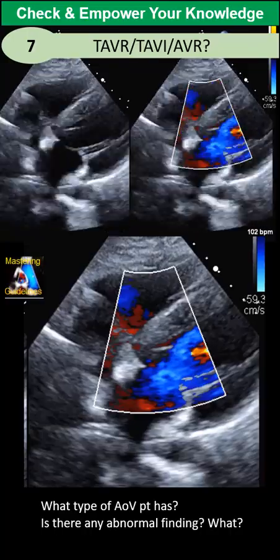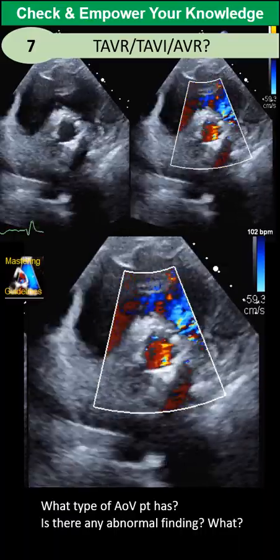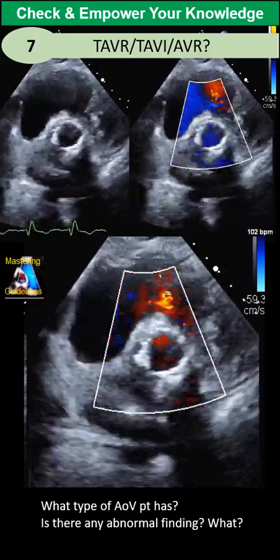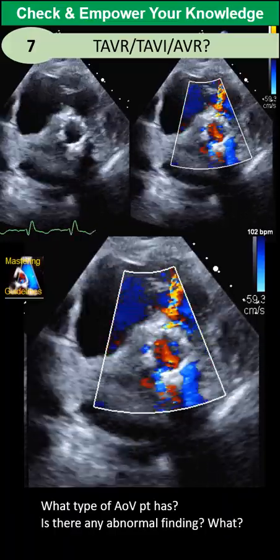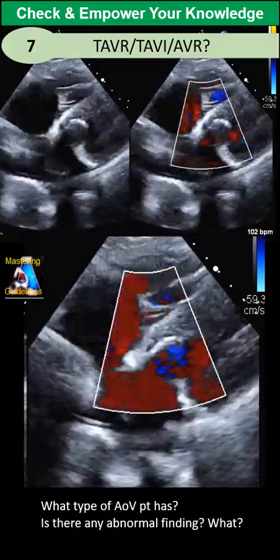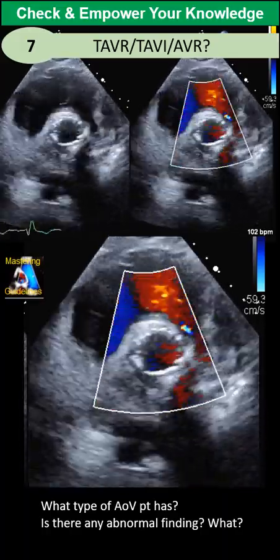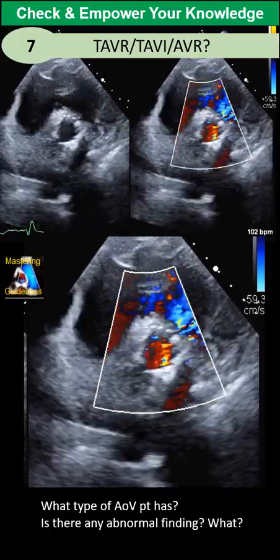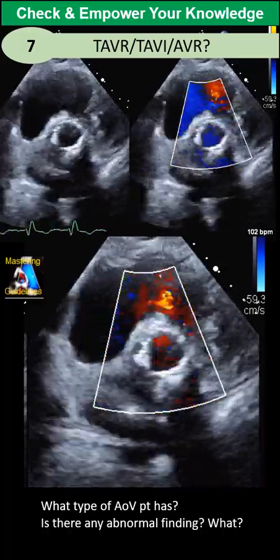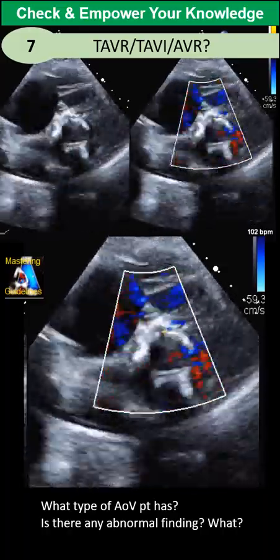Hi everyone, we have another interesting case. The patient came and we tried to get a parasternal view, but unfortunately the window was poor and we didn't get any conclusive images. Finally, we moved to the subcostal view and obtained this image.